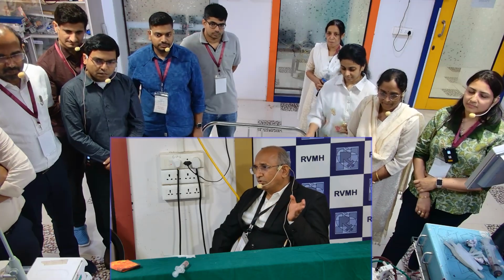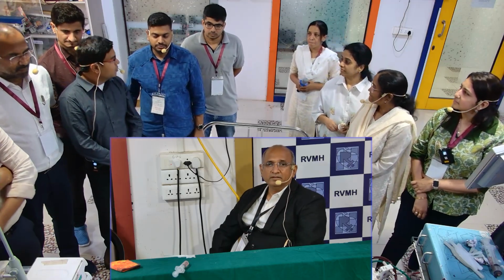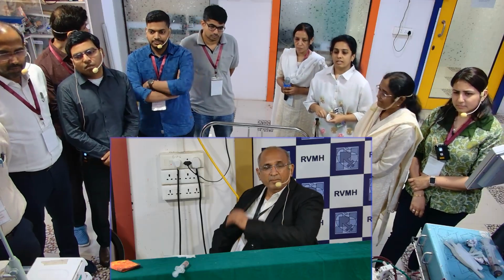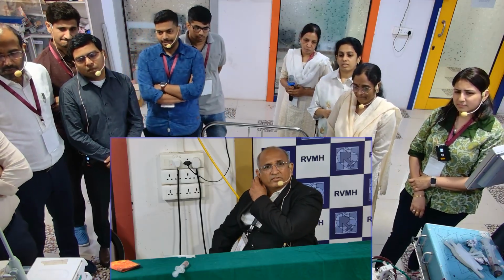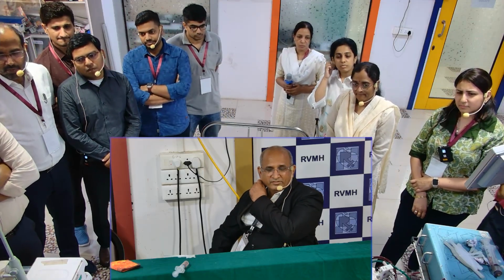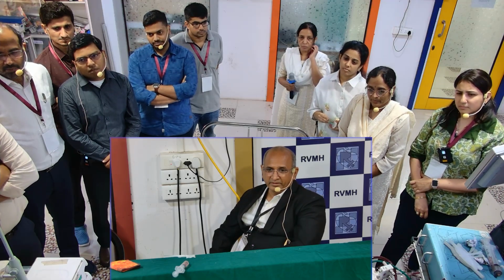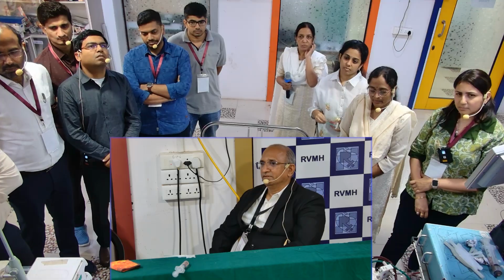Before you go, sir, what did you learn? For membrane edema, what will be the feature in that case? Membrane edema will present only with the CO2 going up. Rest of the things will remain the same; oxygenation will be maintained. Okay, sir. So that's one point you learned.